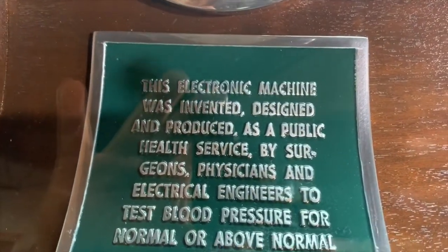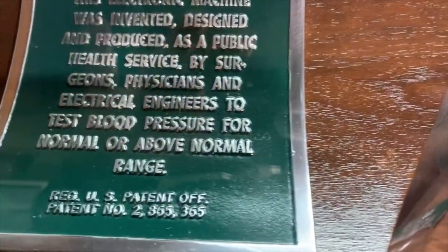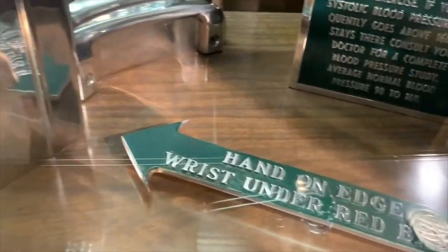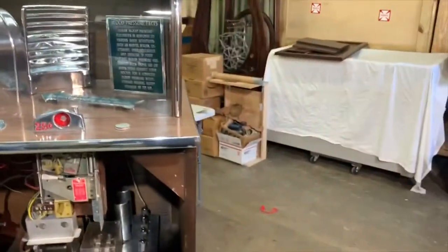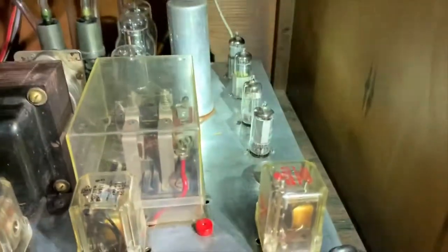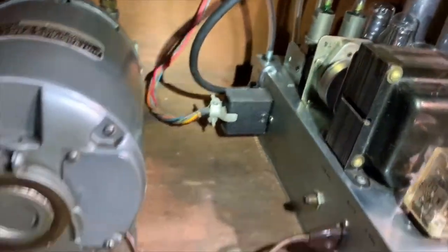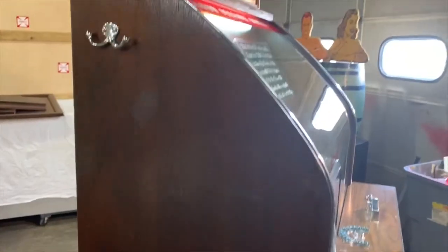Here are some of the plaques on the machine — if I look up that patent number it may reveal a manufacturer. What a cool piece. You can look at all these tubes inside here, and on top of everything it's coin operated.